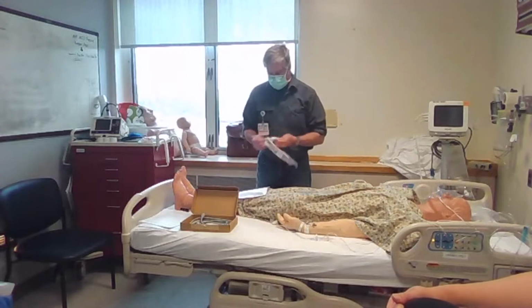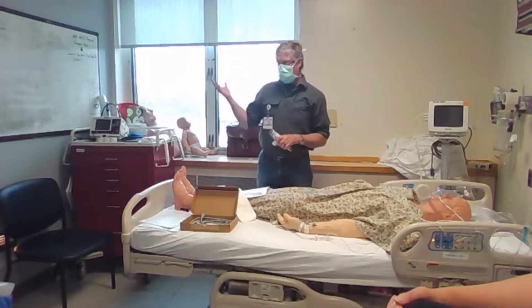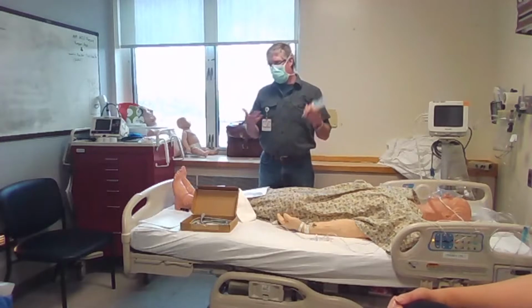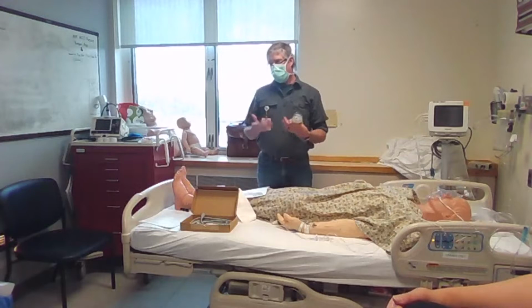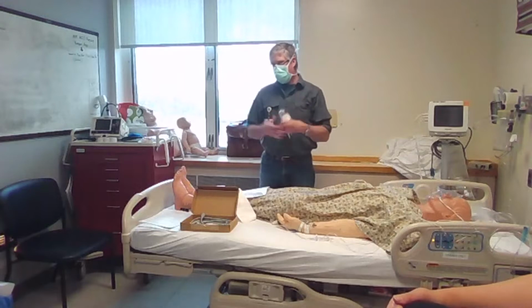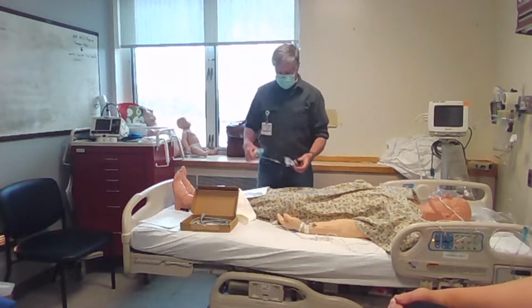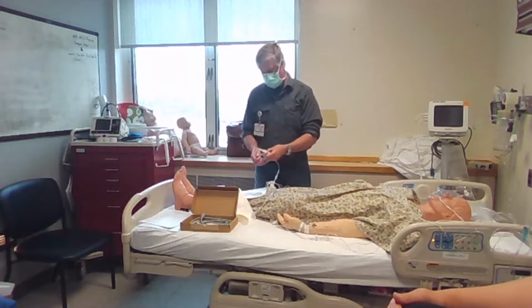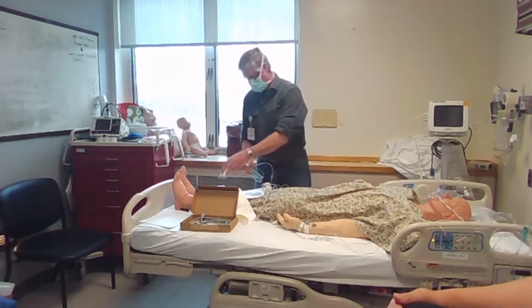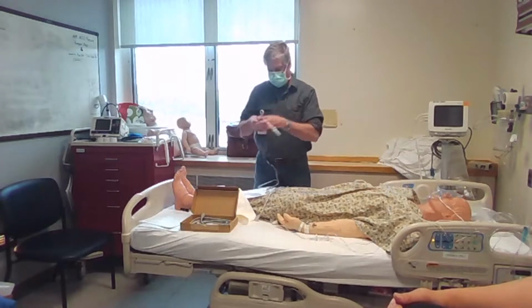Okay, indications. So let's set one up, okay? All right, so typically you're also going to need a pressure bag, and you can use really a 500 or a liter bag to set one of these up, but a 500 is usually what people see. But if you're in a pinch, you can do either one of those. You could probably even get by with a 250, but it'd be so small in the pressure bag that it really wouldn't fit well. But so typically 500 or a liter bag. You've got your portion that goes into your 500 cc bag. Lock it down first.